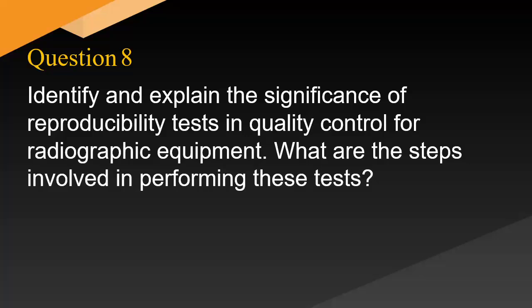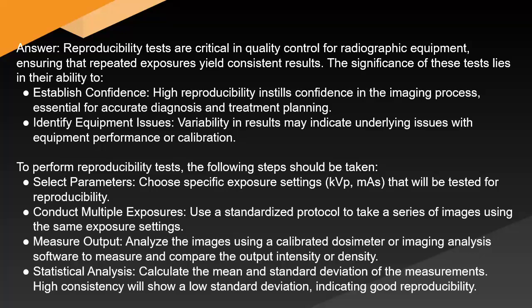Identify and explain the significance of reproducibility tests in quality control for radiographic equipment. What are the steps involved in performing these tests? Answer: Reproducibility tests are critical in quality control for radiographic equipment, ensuring that repeated exposures yield consistent results.